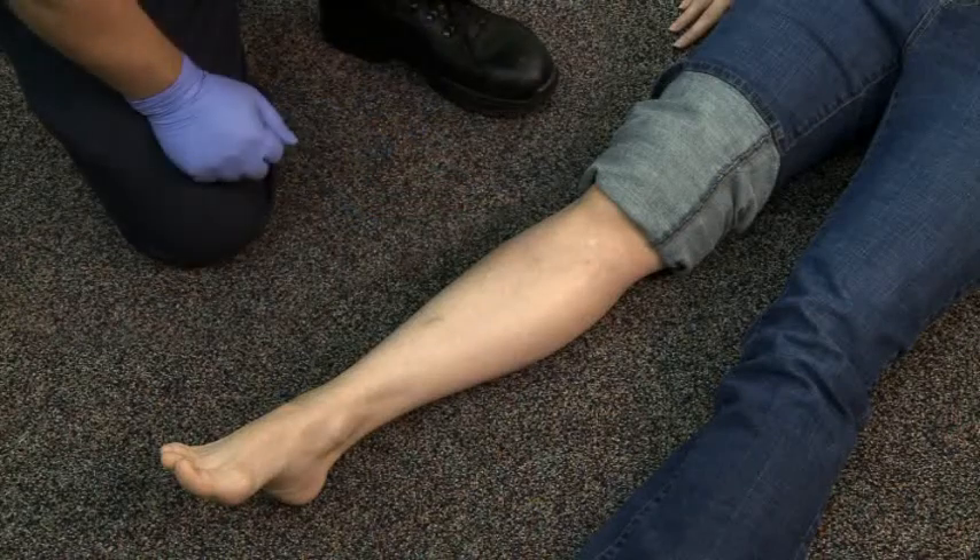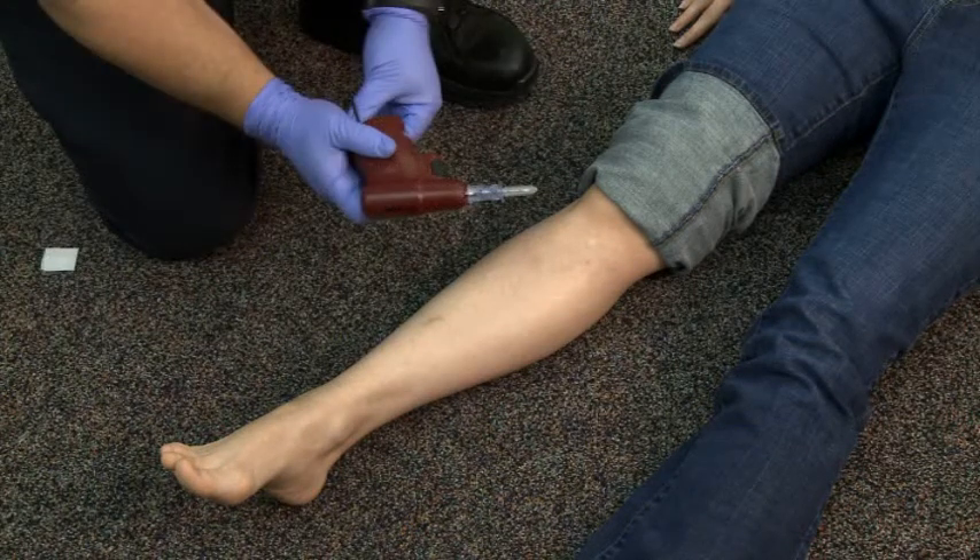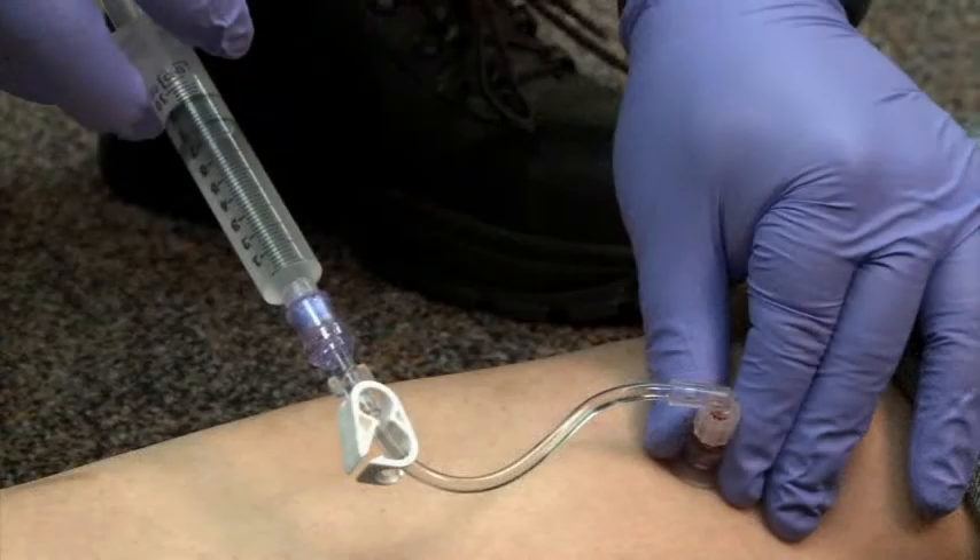Place the patient in a supine position. If available, another provider may help stabilize the patient's leg. Assemble the equipment, which includes the battery-operated drill, appropriately-sized I-O infusion needle, syringe and tubing filled with at least 5 cc of sterile saline, antiseptic, and tape.